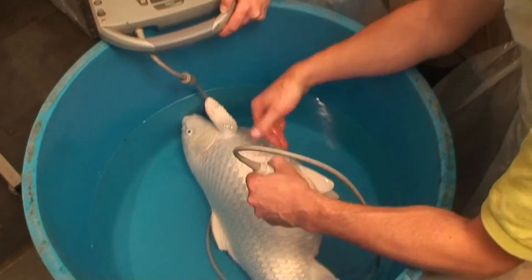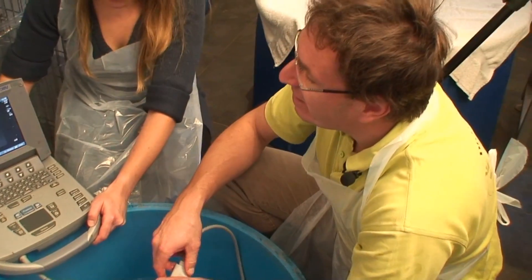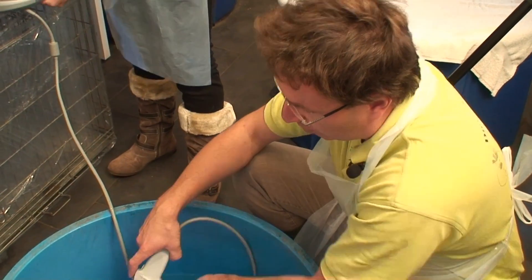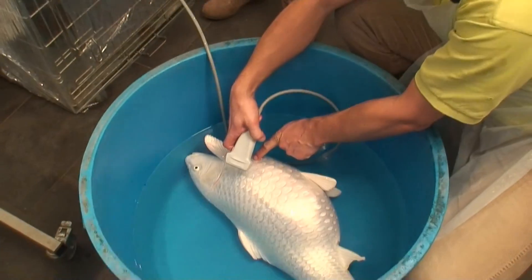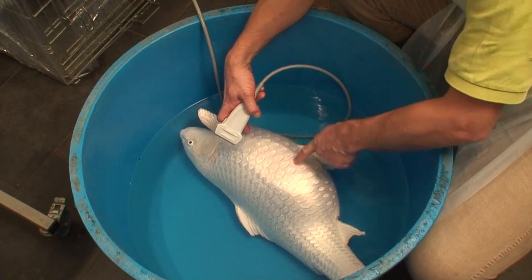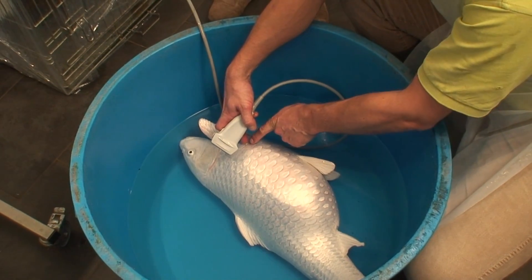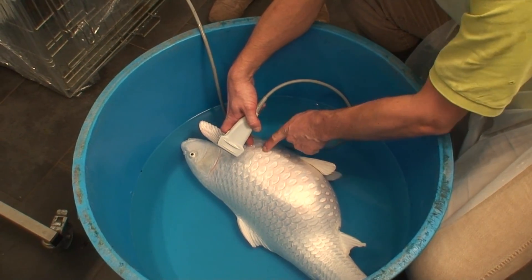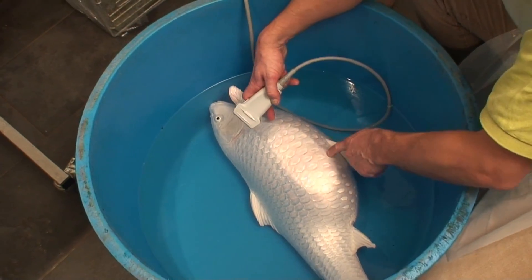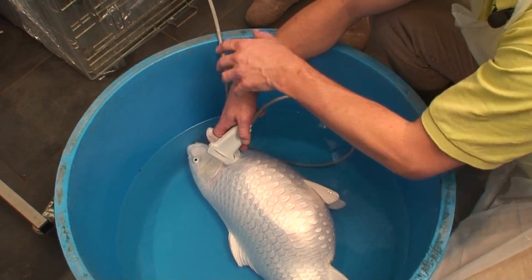What we will plan for the surgery: we have to open the fish on the right side. First of all, we have to move all the cameras and turn them around. In the meanwhile, we will prepare the fish for the surgery. We'll take one line of scales off just below the ribs. Then we suck out all the fluid, and then we get space in the abdomen to take the tumor out.